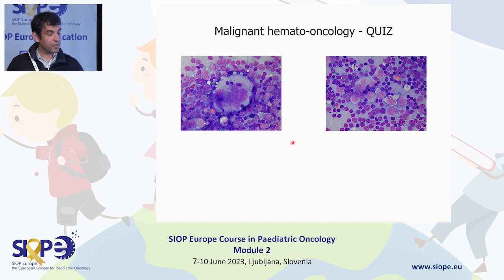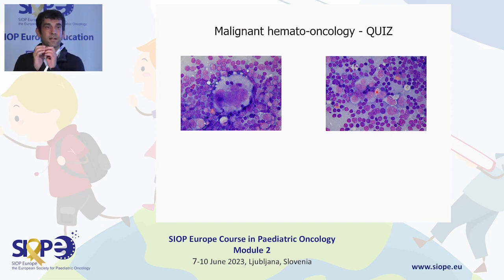Okay, this patient, we have learned this in the first module, had a lymph node resection. It was an adolescent, and here you can see a pathologic cell. Although the diagnosis in this case is usually made by histology, you can have a clue by cytomorphology. You can see a multinucleated cell here. You can see eosinophils, and usually the malignant cells. Hodgkin's. Yeah, this is Hodgkin's. That's correct.